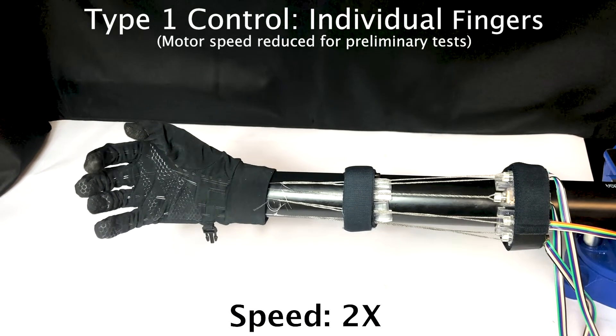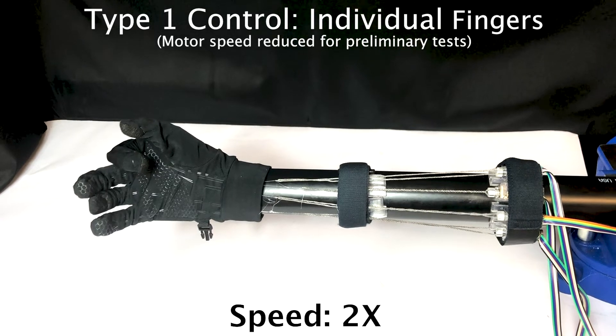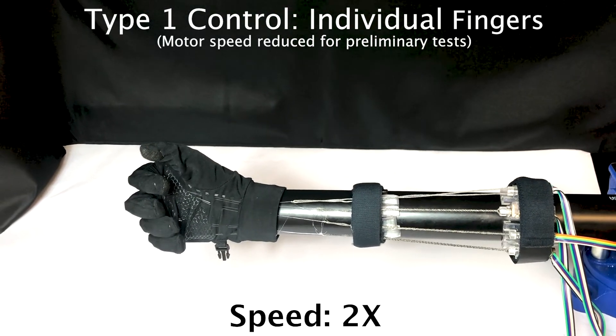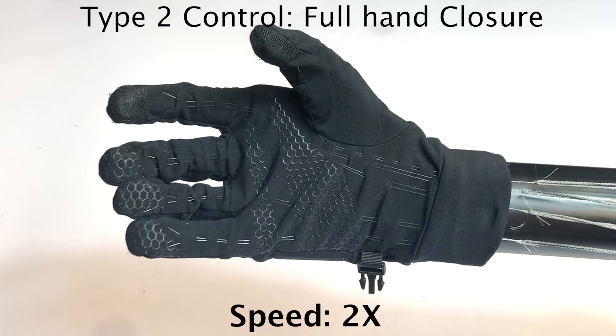Here we show sequential hand close. Full hand close.